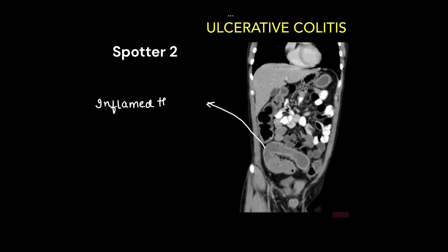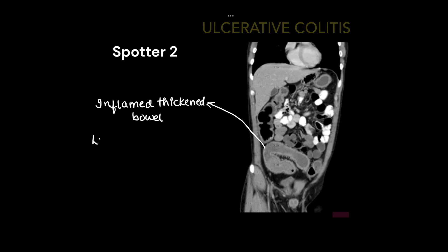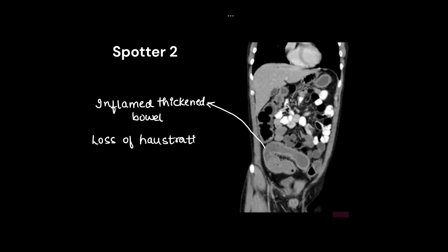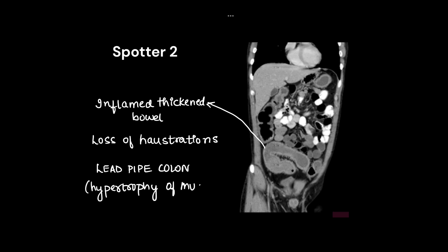This is ulcerative colitis on CT. We can see the inflamed, thickened bowel wall, and there is loss of haustrations, which gives rise to lead pipe colon. This mainly happens because of hypertrophy of the muscularis mucosae.